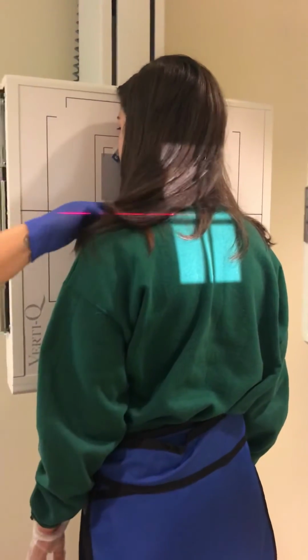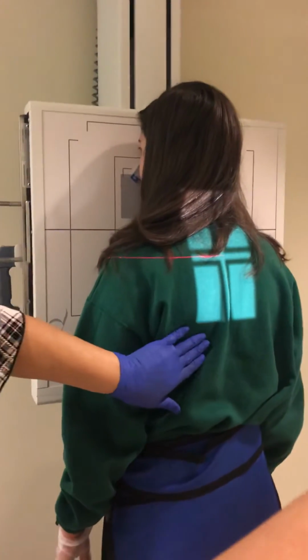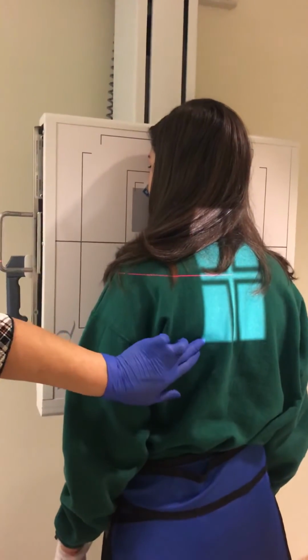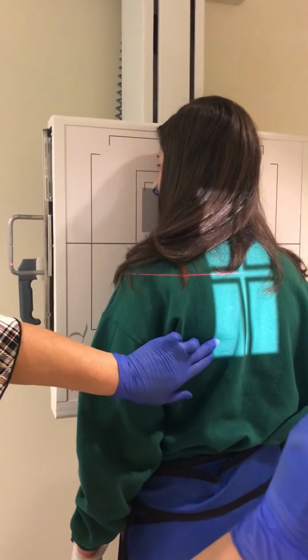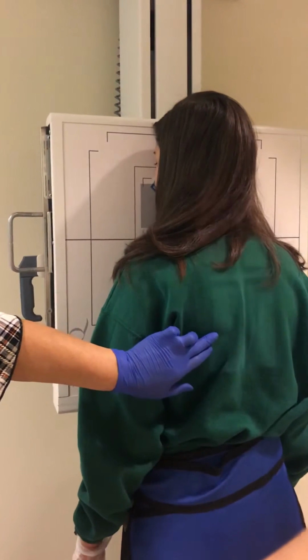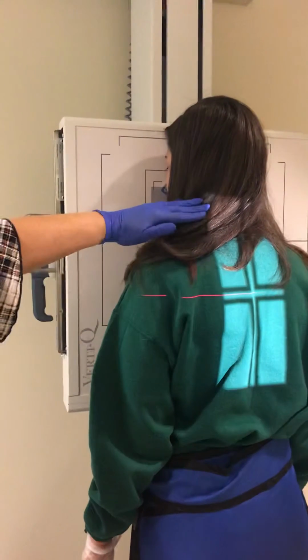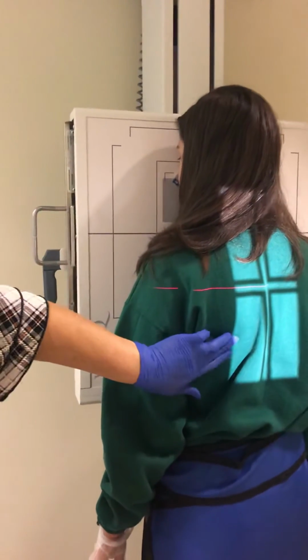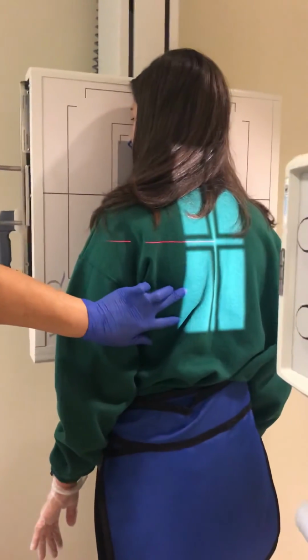So I want to make sure that I have light above the jugular notch, but I also have light below the xiphoid tip. Right now the bottom of my light is hitting at the level of T7. So what I'm going to do is open up my light field, and then I'm just going to readjust the height here so that I'm midway between. And you see how I have light above the jugular notch and below, about 2 inches below the T7 or inferior angle of the scapula.